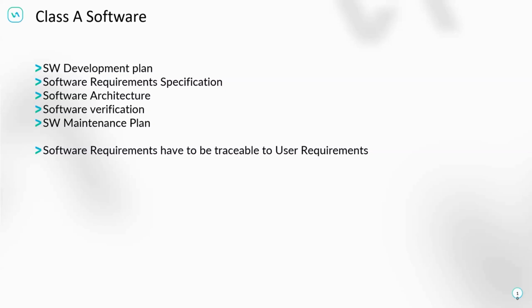So these are your basic steps. And the others can be done additionally. Quality requirements, for instance, I normally don't use, except if I have a certain quality framework to be given, like a sensitivity or specificity of a certain recognition, then yes.